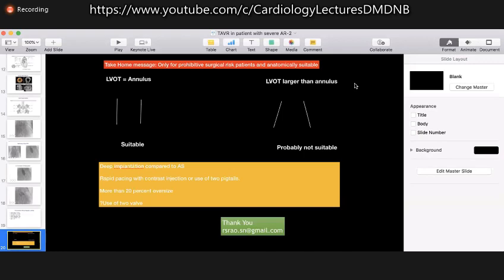And I really agree with your opinion that when you have pure AR, the balloon expandable valve is the best choice. Recently, I had one case with really low calcium on the leaflets, mild stenosis and severe AR. We started with a self-expandable valve. We were really lucky that we implanted this the first time, because the patient crashed on the table because of the bad LV function. But if you have a balloon expandable valve, the procedure is really short. Yes.